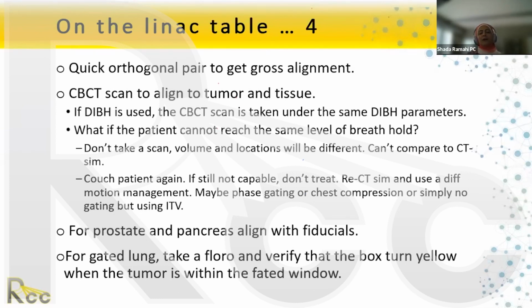The question is, why do we care about spine alignment if we're concentrating only on the tumor? It's a very good rationale. In the abdomen you don't have fixed organs; everything is moving. If the internal organs are moving so much that the bone is aligned or misaligned by 1.5 cm or more, it means we cannot guarantee the dose to organs at risk. Remember, we can always register to the tumor, in this case the pancreas, and we get the dose to the tumor right. But what about the dose to the small bowel? Will it dose the kidney or the spinal cord if things are really moving a lot? So that's her rationale.